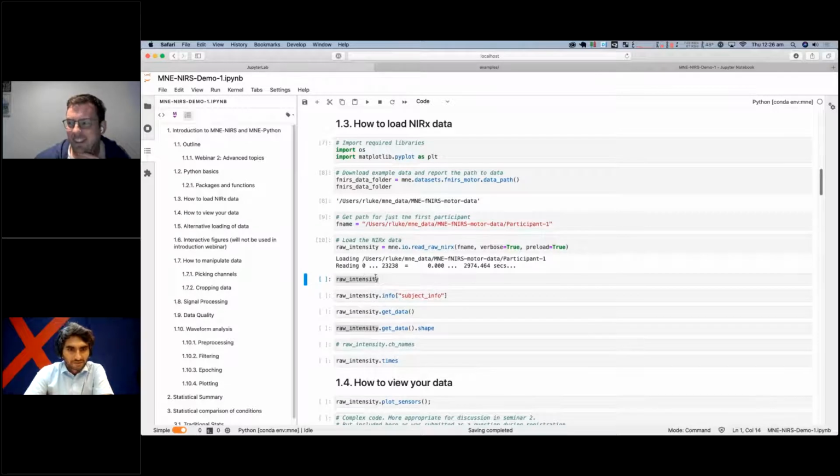If I may interrupt here, there's a question on data formats. Someone is asking, is there an option to bring data into the BIDS structure? Yes. To get it into BIDS, there's actually a little side project I've got which does that, and I can provide a link at the end, and I'll show you if your data is in BIDS how to read it right now.